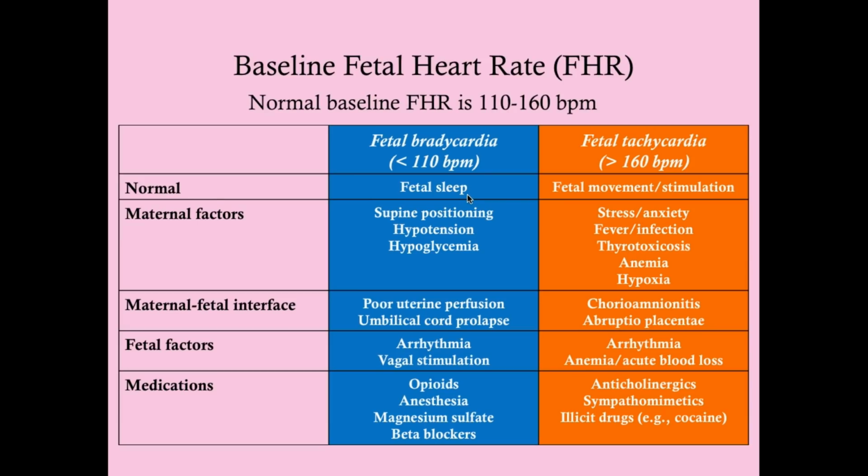So if you're doing an auscultation with the Doppler and listening to the baby's heart rate and mom's in the clinic, baby could be sleeping. Probably not sleeping during labor so much. I mean, you've got all those contractions. You know, if I put a vice up to your head and contract your head, you're probably not going to sleep too much either, right?